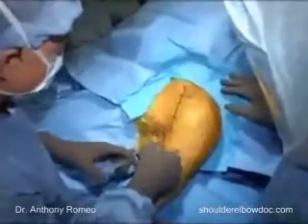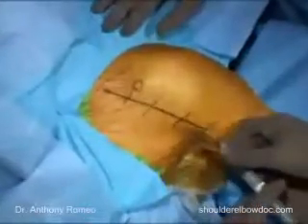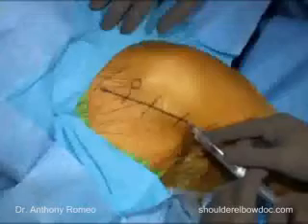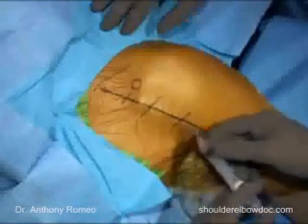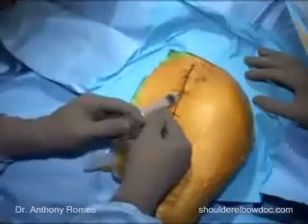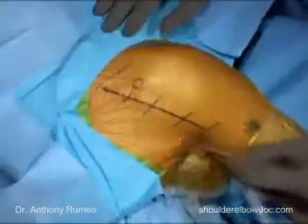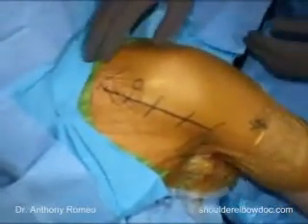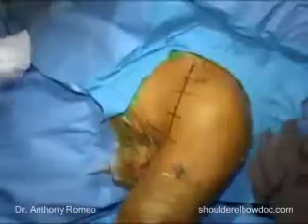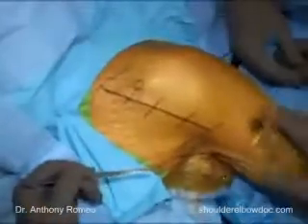Once the draping is completed, we will anesthetize the skin with a local anesthetic. Our patients routinely receive an interscalene block, which is complemented by a general endotracheal anesthesia. This has worked very well both for intraoperative management of the patient and for postoperative management — patients are capable of getting up and out of bed the night of the procedure, which helps to improve recovery from the operation.